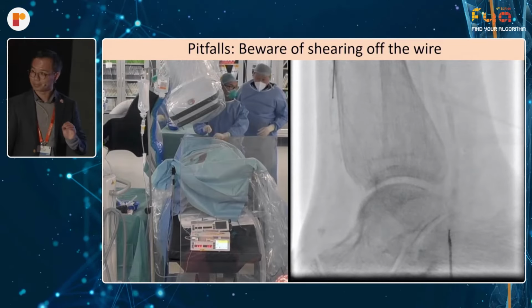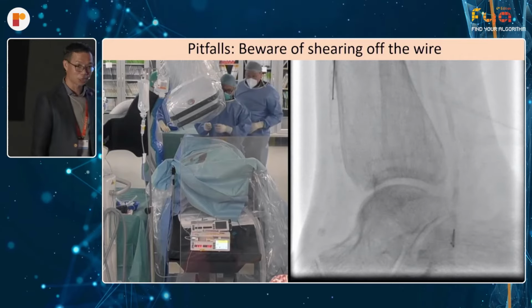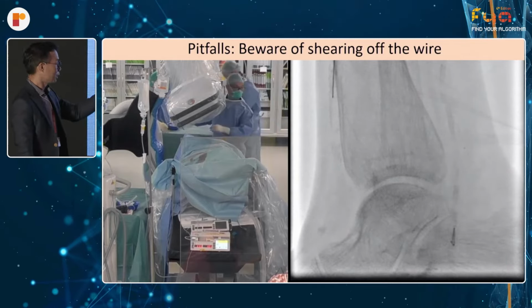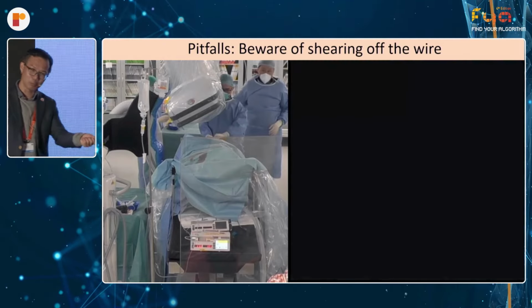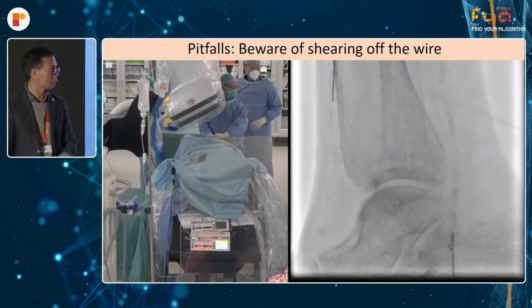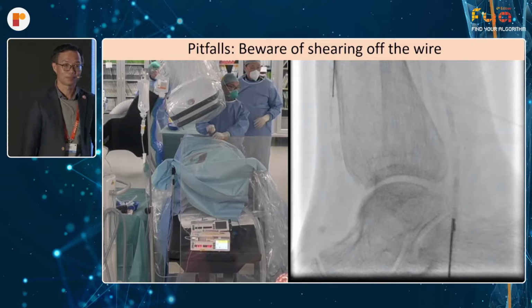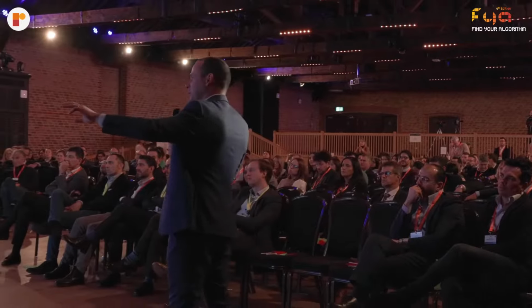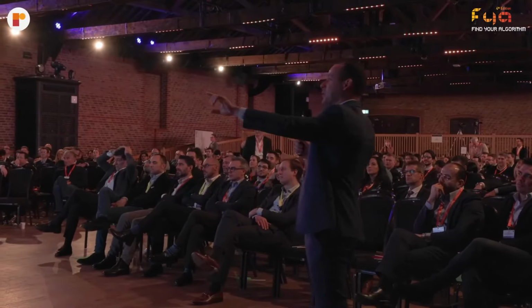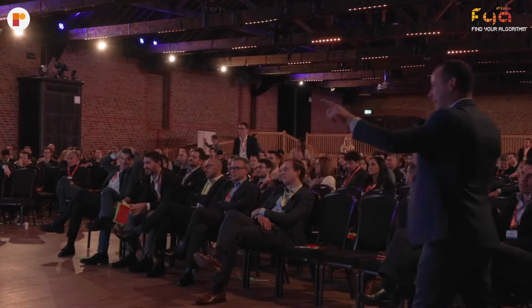Yes, and the other pitfall is, as we mentioned earlier on, beware of shearing off of the wire. This is a 21 gauge, and this is a V18. If you feel it getting caught, forget it. Pull the whole thing out, wire with the needle, and don't leave your wire in there. My nurses are always worried: you leave a piece of a guide wire in the UK, it's almost like killing a patient. You don't care about the recanalization, but if you leave a piece of a guide wire, it's super bad. But you see, it happens also in other countries, guys. It doesn't happen only to me.